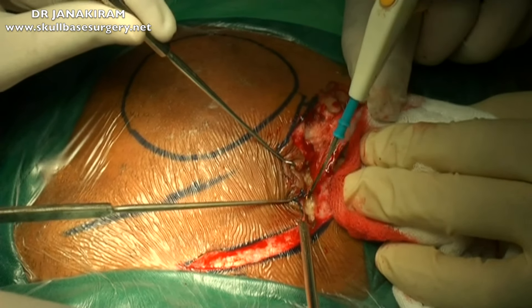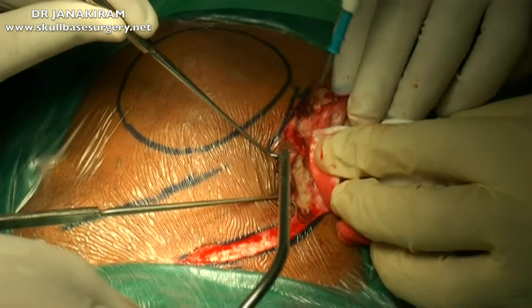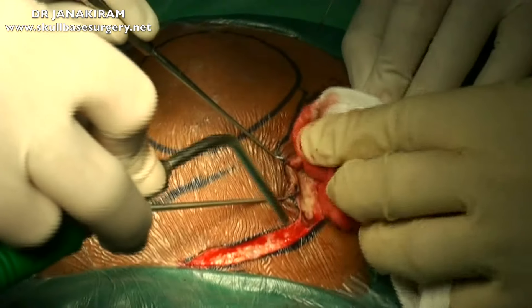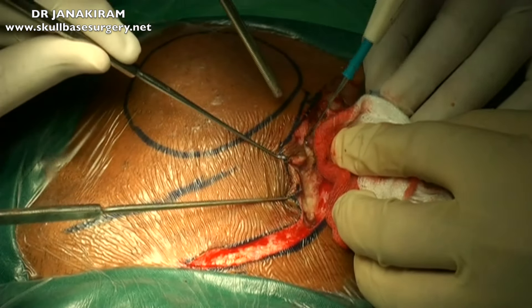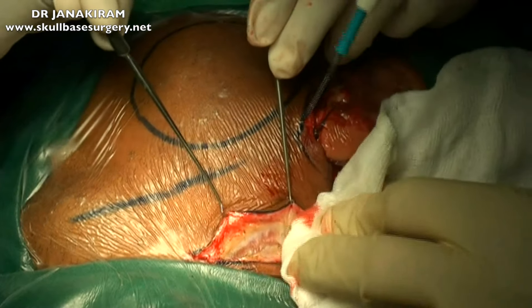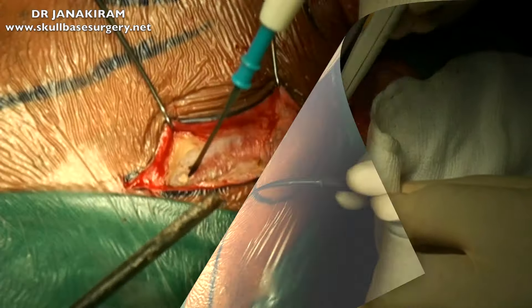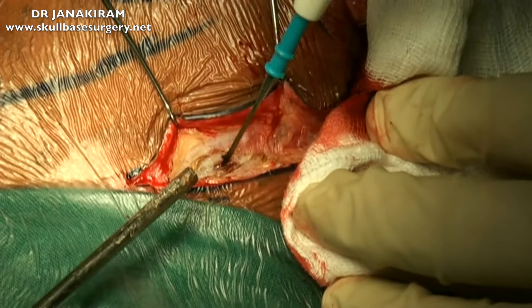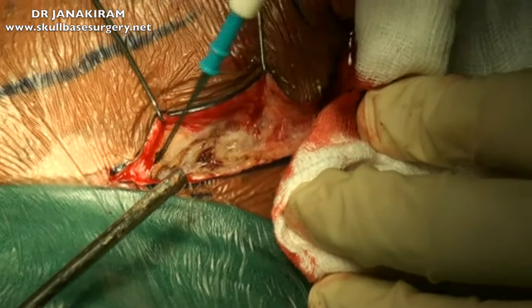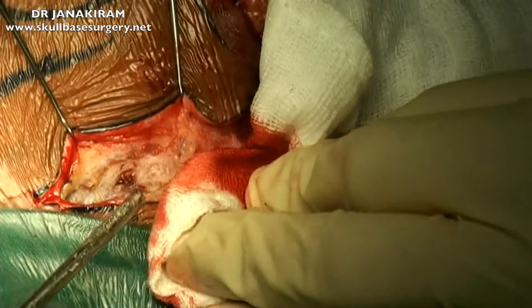Once the incision is made, we use unipolar cautery to elevate the skin flap, as you can see here. It is by the principle of traction and counter traction that we elevate the flap. We can see that elevation is almost bloodless. In the cervical part we identify the platysma, as you can see here, and we cut the platysma and elevate it superiorly. This resection is almost bloodless because you are going above the level of the parotid gland.